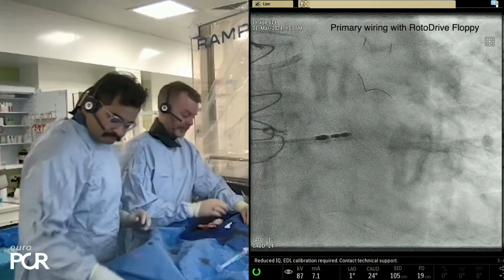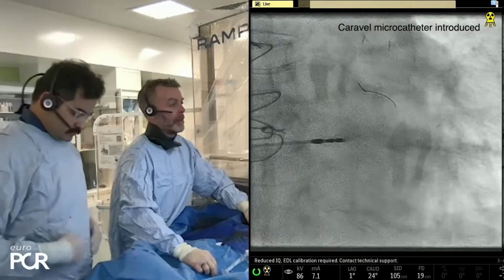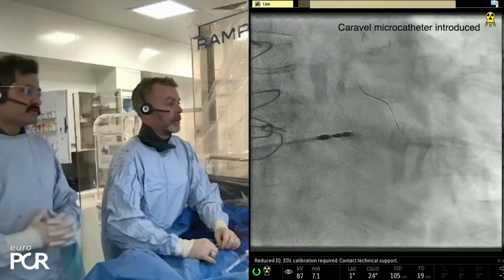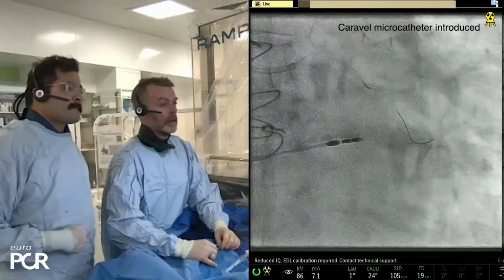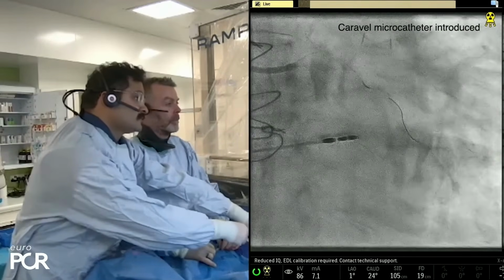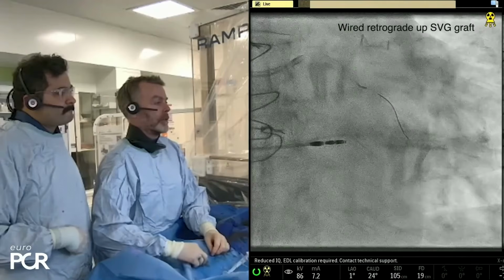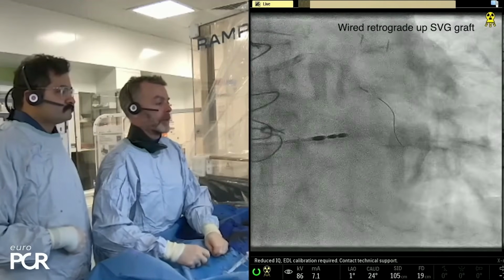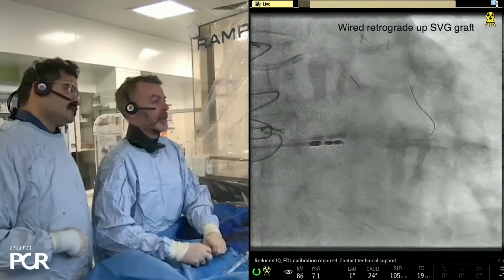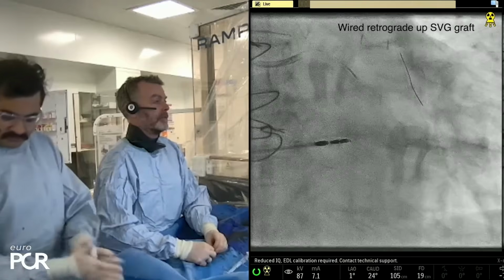Let's swab, please. Let's just open a trapper balloon for later, please. Where's that going? A test? No, it's a little funny. See if it will go the other way, though. No, I think we'll take that. That's the right graft, is it? Yeah. Perfect. We'll leave that up there. Brilliant.